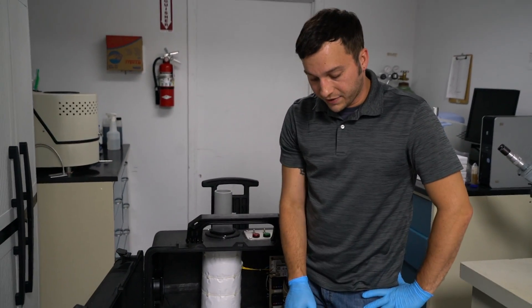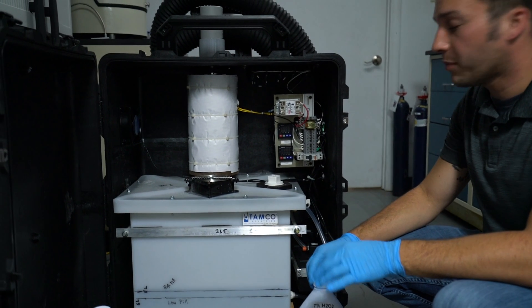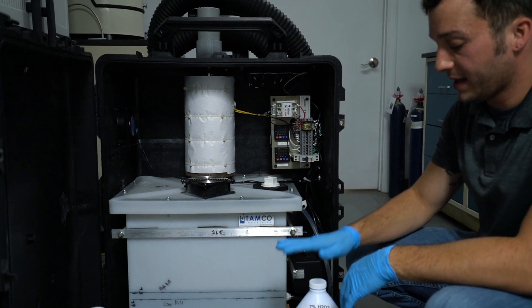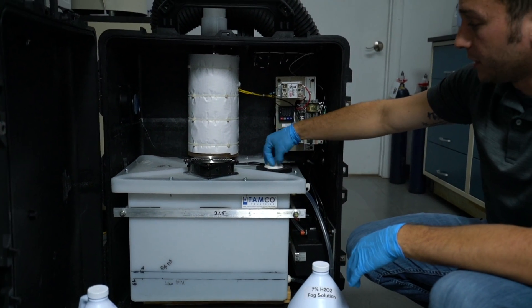For this video demonstration we are going to be using distilled water in place of the hydrogen peroxide just for safety reasons. The first step in operating the disinfection system is to add solution to the reservoir tank. To do this we will simply remove the fill plug.